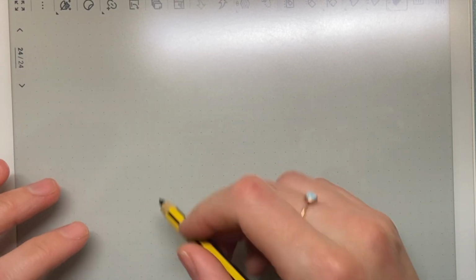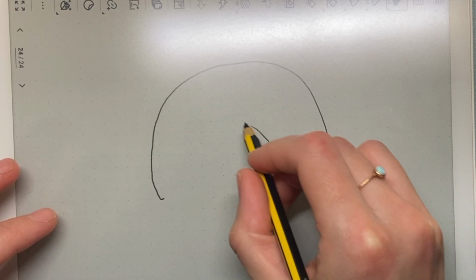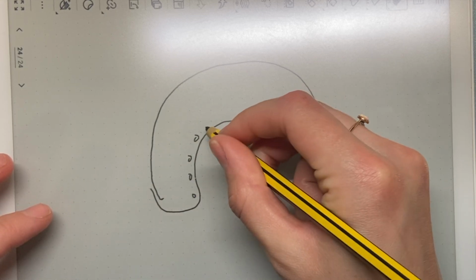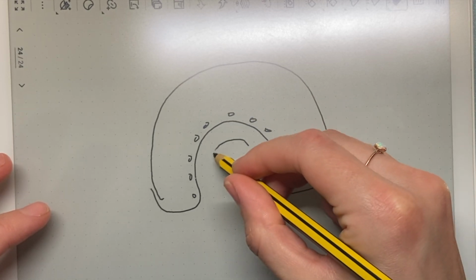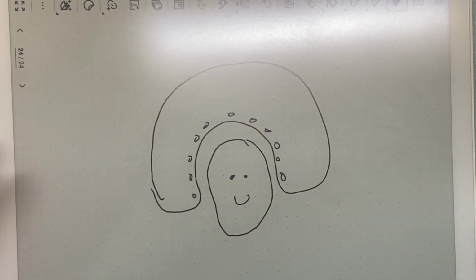So just for context, for this tutorial, I'm going to be talking about an MEG experiment. So that's recording the magnetic fields around the head. Okay, so to help us better understand what source space is, let's look at the actual MEG. And that looks like this helmet here, which I can't draw in 3D. And this helmet has a bunch of sensors that go all around. And let's say this is our head that we have here with our lovely happy participant.